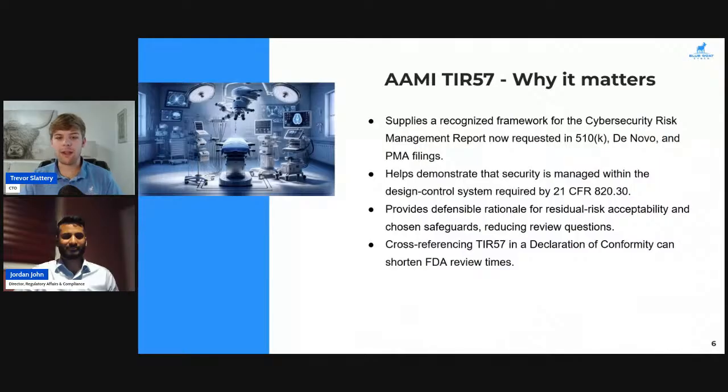Definitely. Yeah, we want to make sure this is an early process, since risk can show up in a product or in a process right at the beginning. We don't want to have to deal with it ad hoc and then move into a standardized process later.